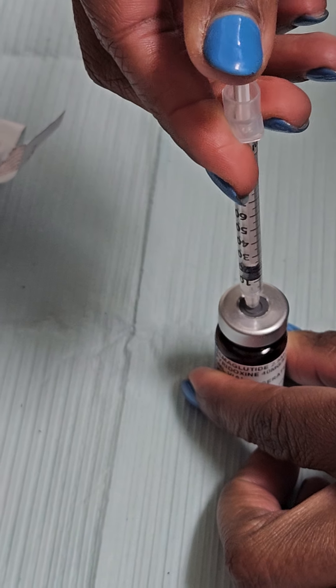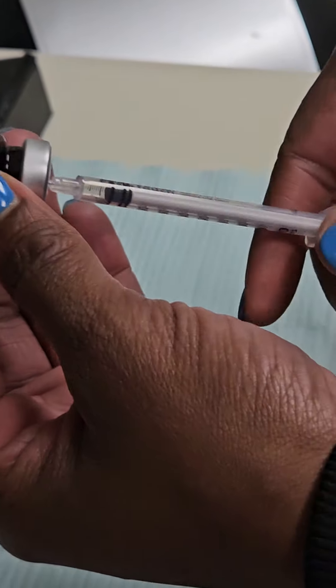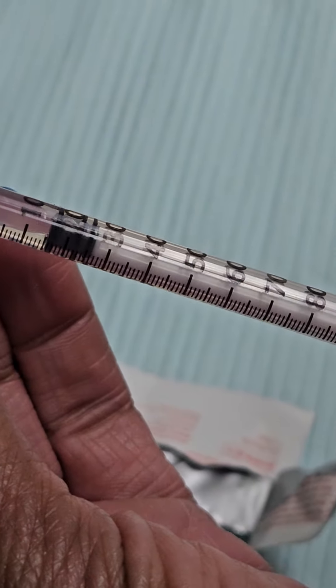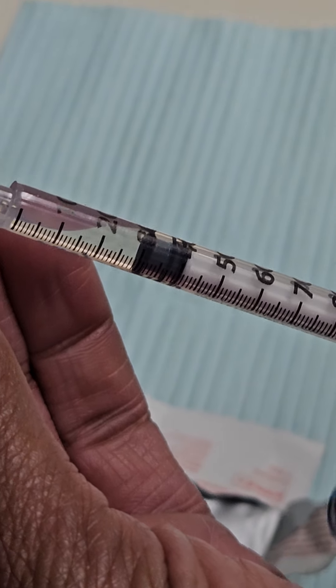We're going to insert the air, then take our vial and lift it upside down. We're going to draw back the amount of medication we're going to give — 30 units. Once we get to our 30, we're going to pull our needle out, place our vial down, and recap our needle.